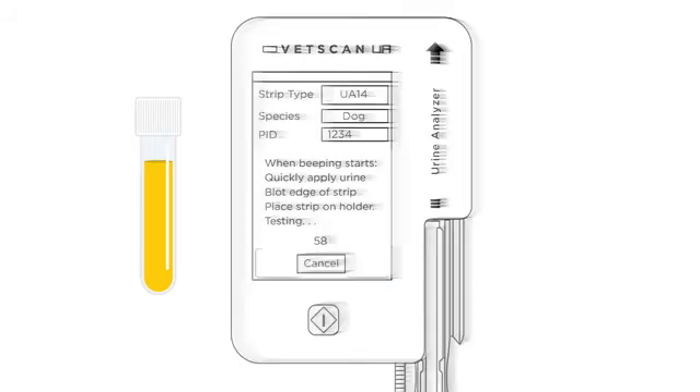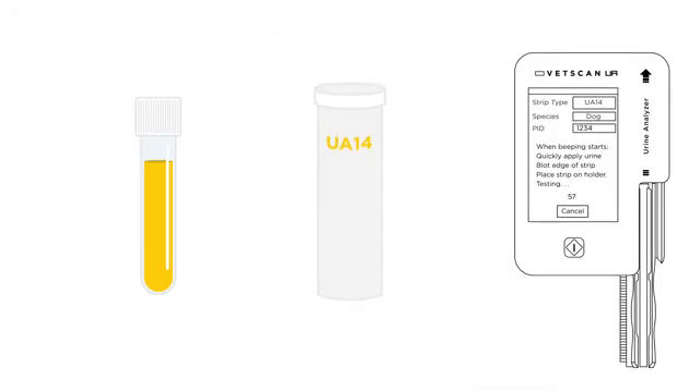A timer will appear on screen and a beep will sound in several seconds. Within 30 seconds, complete the following steps: remove a UA strip from the vial and quickly recap the vial.